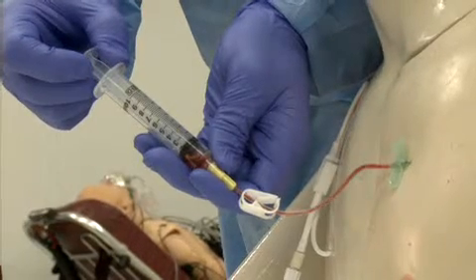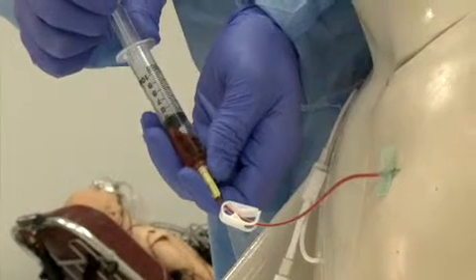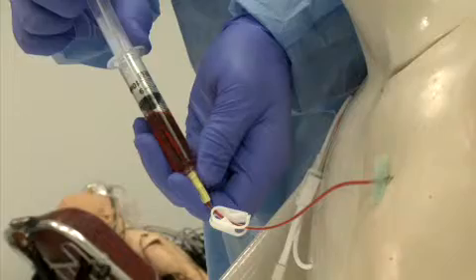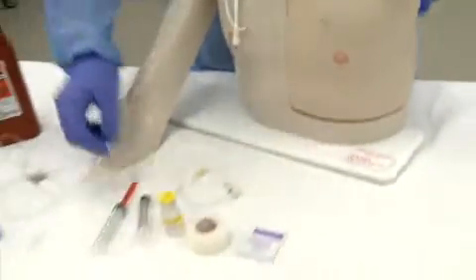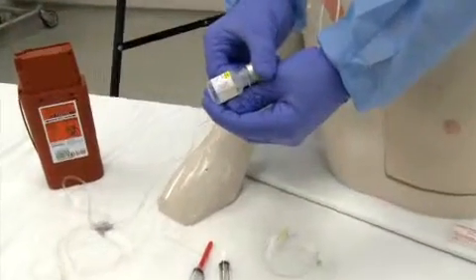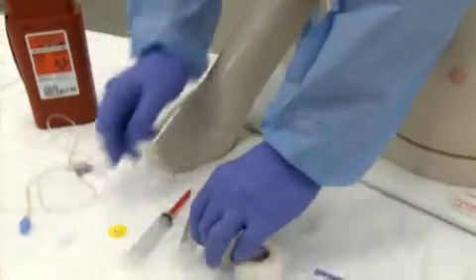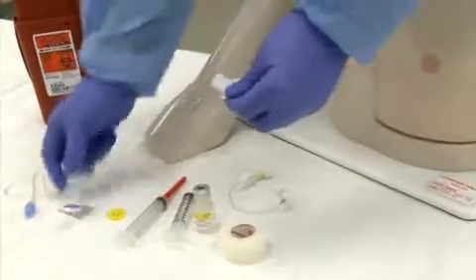This needle is required to access the implanted self-sealing disc that is attached to a tunneled central line hidden completely under the skin. Prepare your equipment in advance as you would for a Hickman-type CVAD demonstrated earlier. This includes 2 10 cc syringes, one filled with normal saline, the Huber needle, and alcohol swabs.